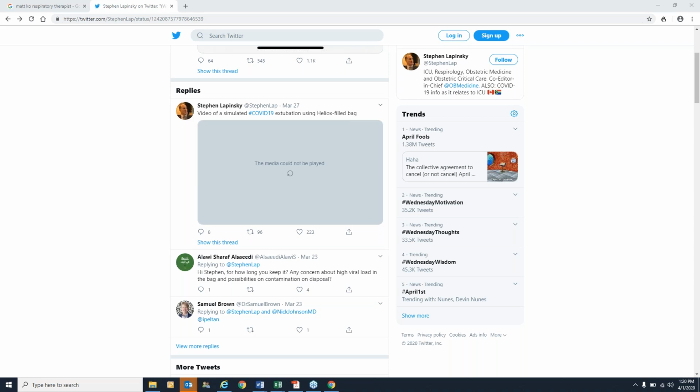It's such a loaded question. We have tried to ventilate in the past using APRV, but to have strict adherence to that 6 cc's. And that's just not the way that APRV was designed to work, because patients get quite hypercarbic using that method. So again, we don't use APRV at our site. I have personal feelings about it, but because I work here, I'm not going to comment.